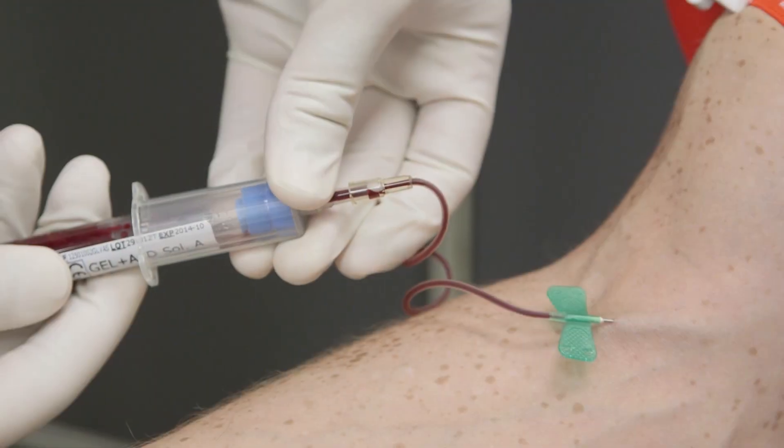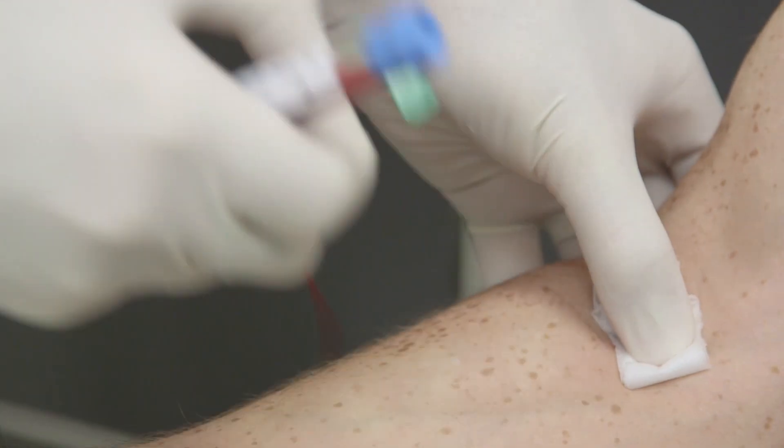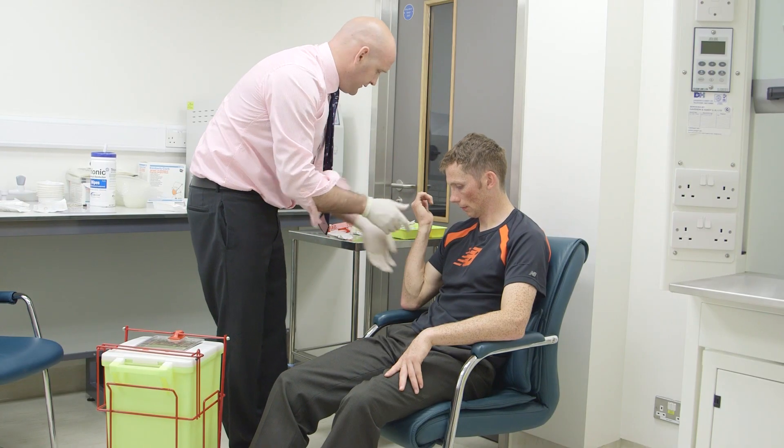Your doctor will then remove 10 milliliters of venous blood, which is stored in a specially designed blood container.